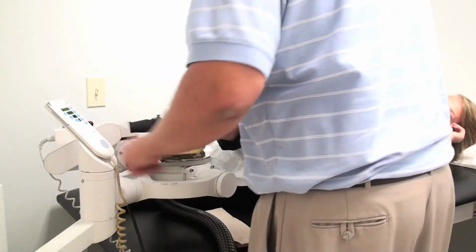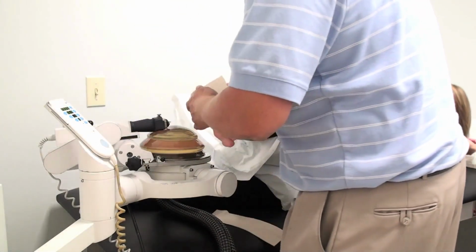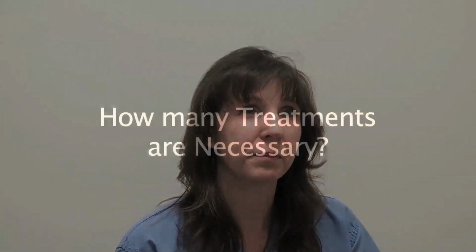And are the results permanent? They may be permanent. If you can figure out what activity, what pair of shoes started the plantar fasciitis, as long as you don't repeat that, and you've learned to notice the symptoms when they start so that we can nip them in the bud, you can be pain-free for a long time. In many patients I've had, they're going on 9 to 11 years of pain-free after their shockwave therapy.